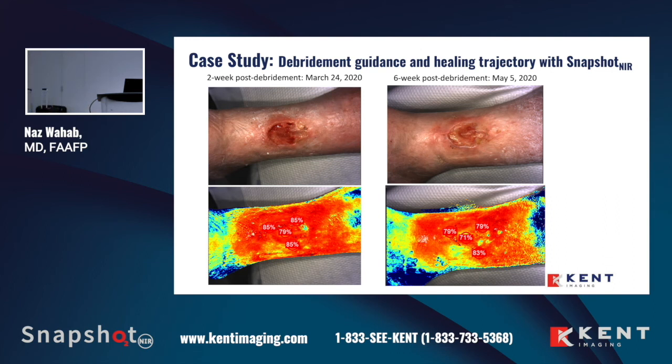And so I pull up a lot of these images to actually give them hard data, not just a pretty picture, because a pretty picture can be given by anybody, but really to give them hard data that no, this is a very tough case. These are probably non-healers in our trajectory of patients. And how are they healing with our interventions?